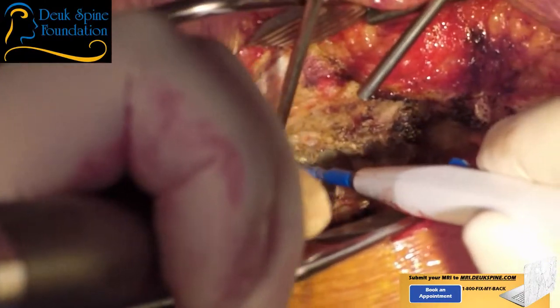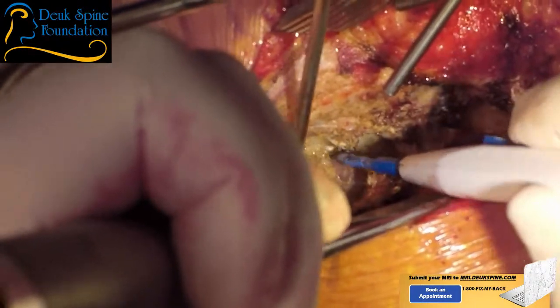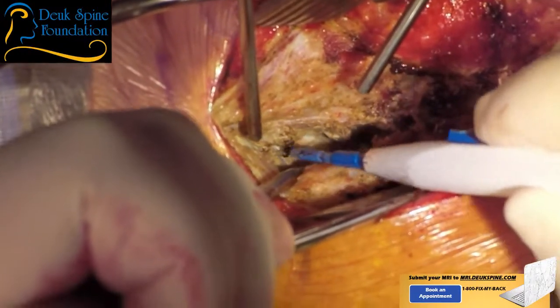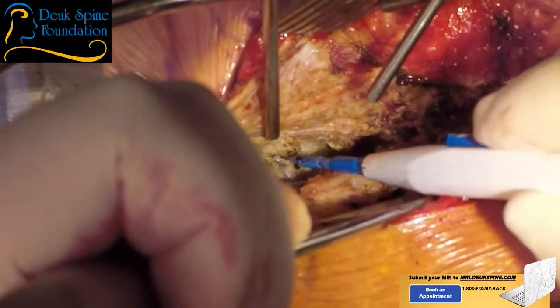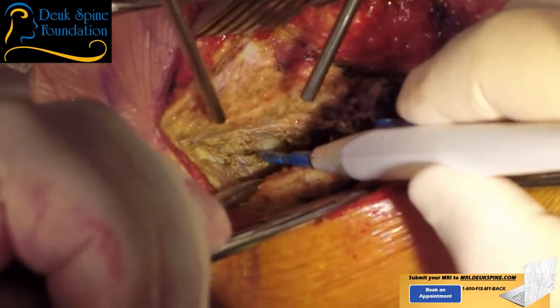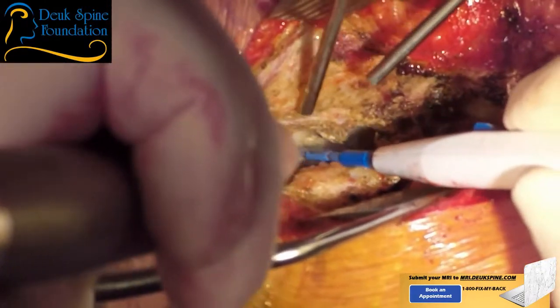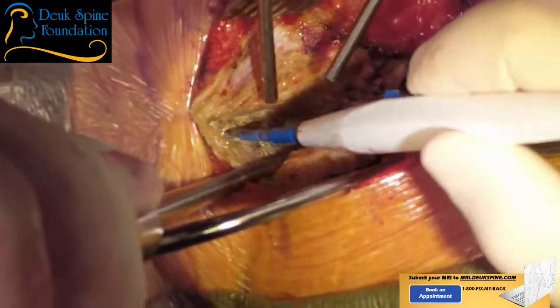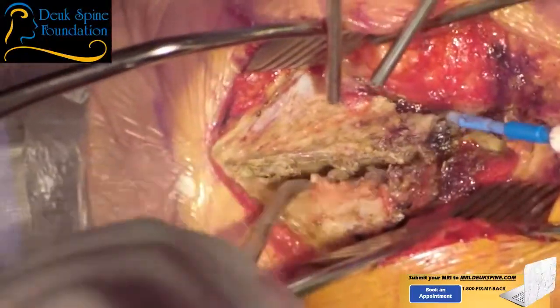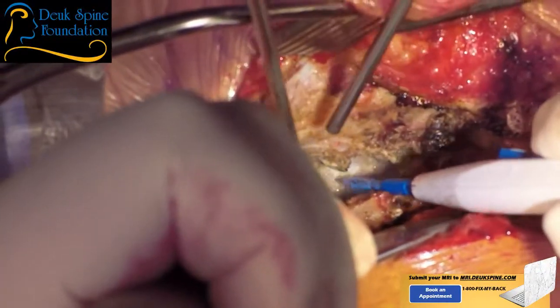It looks excellent. Sorry about the depth of the wound, but so you can see we've lost almost no blood, right? There's no blood coming out. Now, if we didn't position this patient properly and if we weren't controlling their blood pressure, I could see the dura down there between the bones. So you just got to be real careful. You can actually make a mistake and put your bovi between the lamina and you can bovi the dura and the spinal cord. Don't want to do that. So you want to stay on top of the lamina, which is what I'm doing.